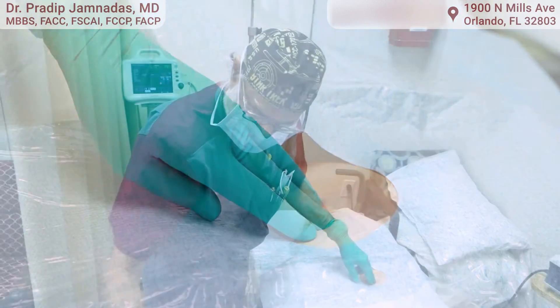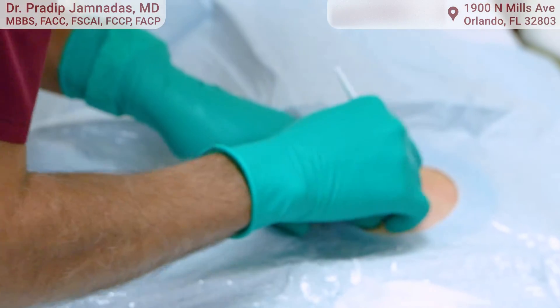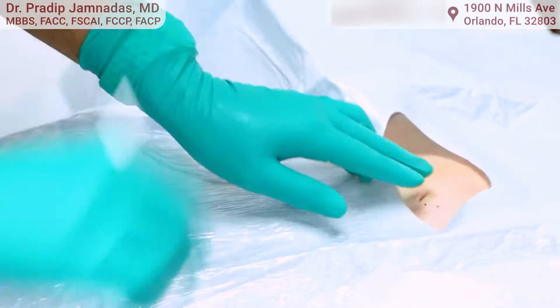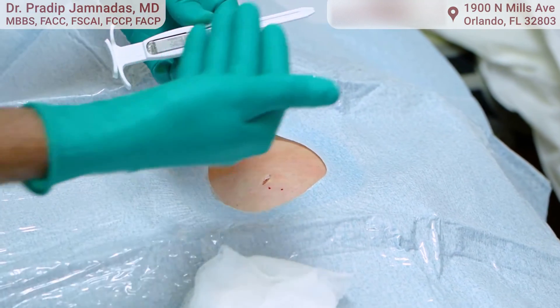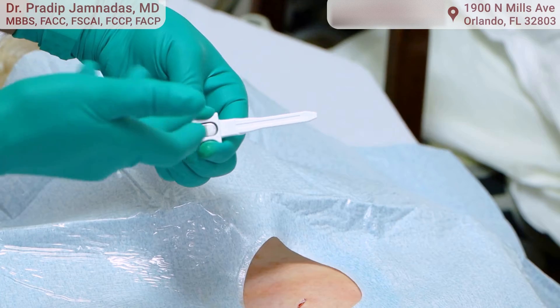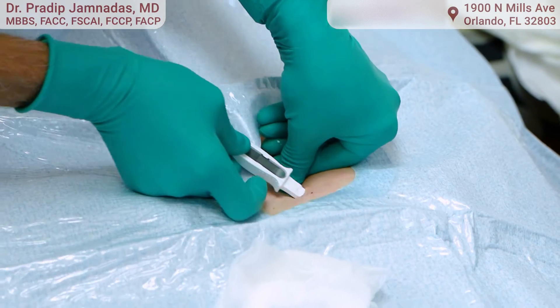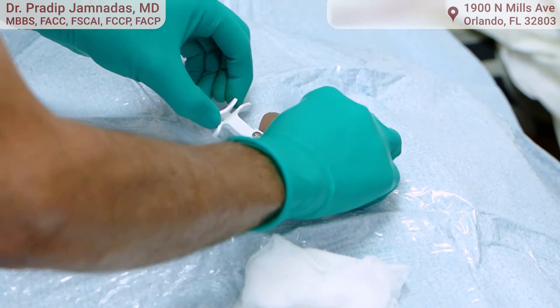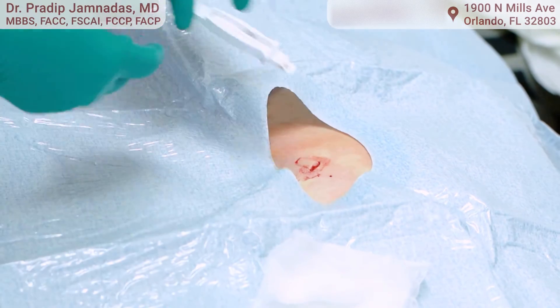Now I'm going to use a little tool to make a small incision — you're going to feel some pushing. This is the cartridge that contains the loop recorder. I'm going to deliver that loop recorder inside using the cartridge to get it in. It's in — and take it out.